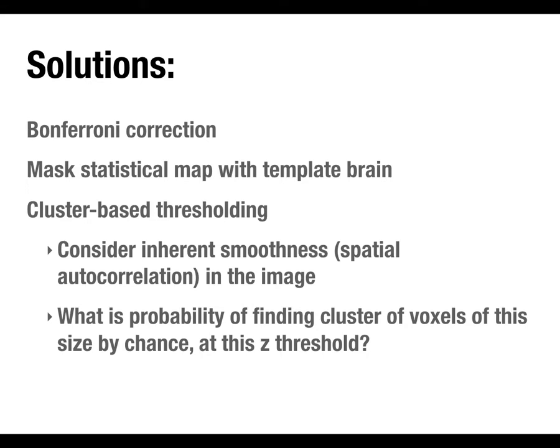Okay, so let me step back. So we run our analysis, we threshold our image at, say, 0.05, and we're likely to get some individual voxels that are lighting up, but then blobs or clusters of voxels that are all touching each other that are lighting up, which are a priori more likely to be active brain areas because there's multiple ones next to each other, which is what we expect knowing how the brain is organized.